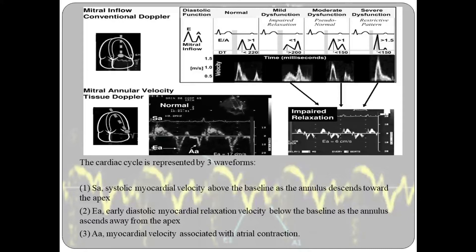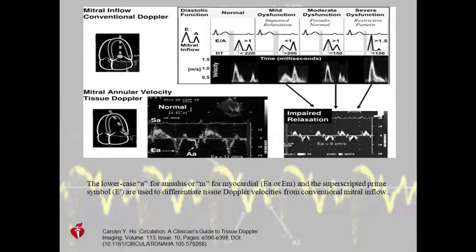This shows two Doppler images: the conventional mitral inflow Doppler and the mitral annular velocity tissue Doppler. We have three waveforms. S' is the systolic myocardial velocity above the baseline as the annulus descends towards the apex. E' (or E prime) is the early diastolic myocardial relaxation velocity below the baseline as the annulus ascends away from the apex. Small 'a' is the myocardial velocity associated with atrial contraction. Lowercase 'a' is for annulus; if written 'M', that's for myocardial wall; and the superscript E prime is used to differentiate tissue Doppler velocities from conventional mitral inflow.